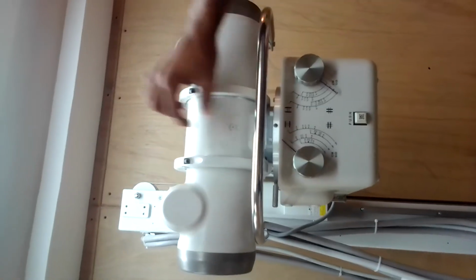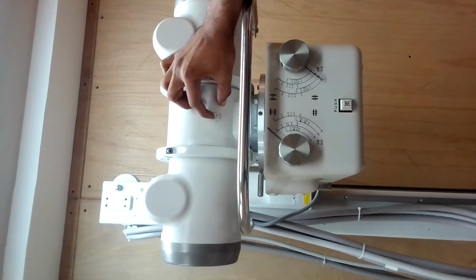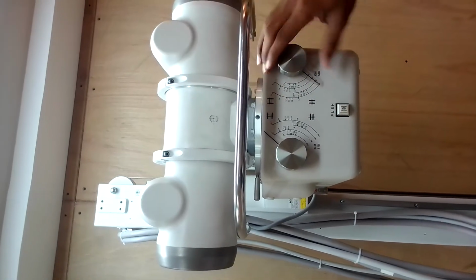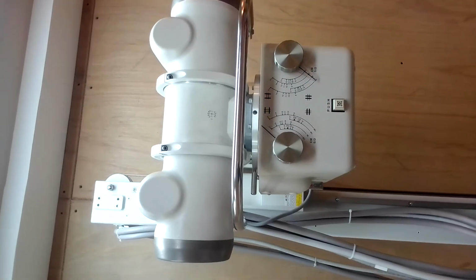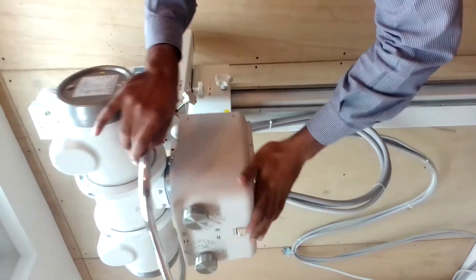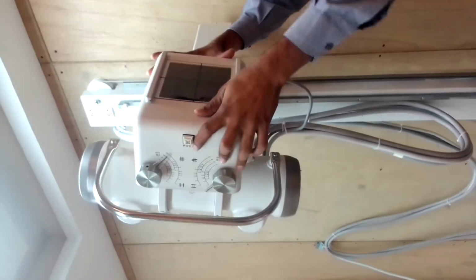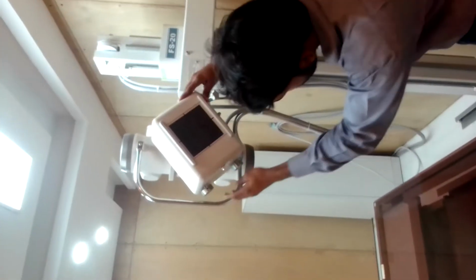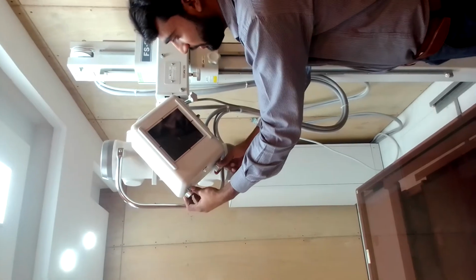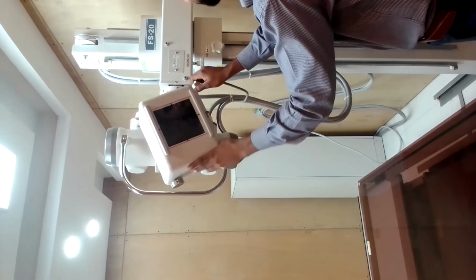Here is the window. X-rays hit on this focal spot, and then the useful X-rays become in this collimator, and here you can see. Let me unlock this. Yes, now I'm going to unlock, and here you can see this is the collimator. Here you can set how much area you want to expose on the patient.